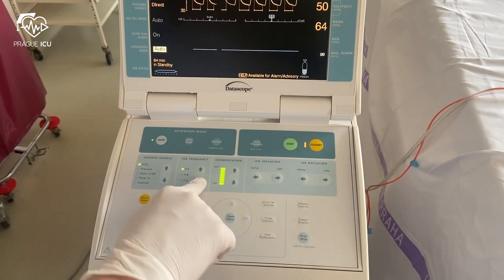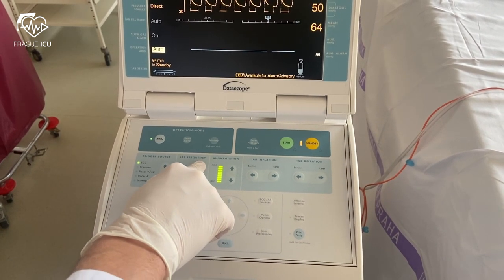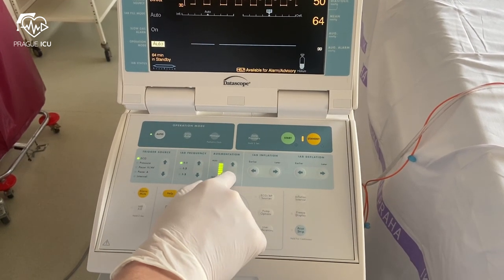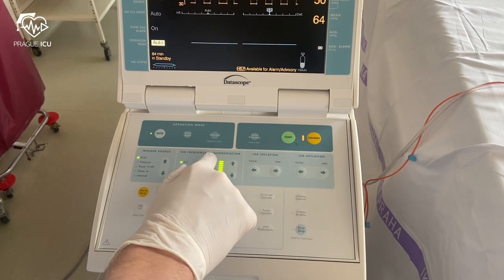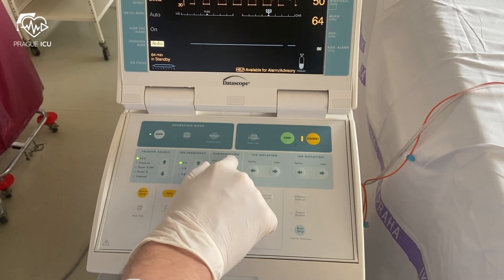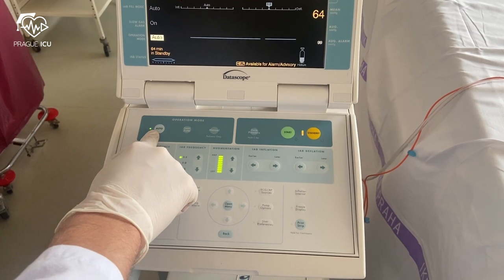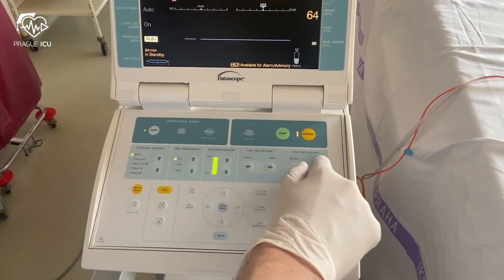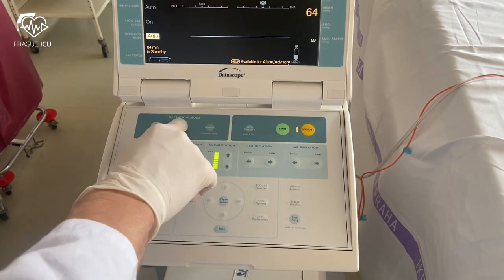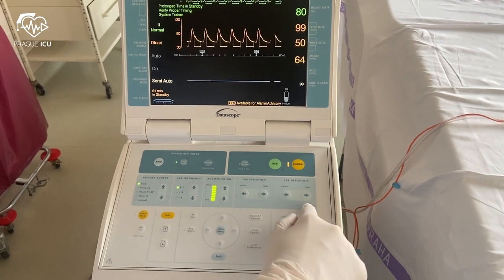During weaning of the therapy, we can decrease the frequency of balloon pump inflation to 1 to 2 or to 1 to 3, as well as decrease the augmentation. We should never decrease the augmentation to less than 50%, as it increases the risk of thrombus formation. In auto mode, the user has the ability to fine-tune only deflation timing. In semi-auto, the user has the ability to fine-tune inflation and deflation timing.